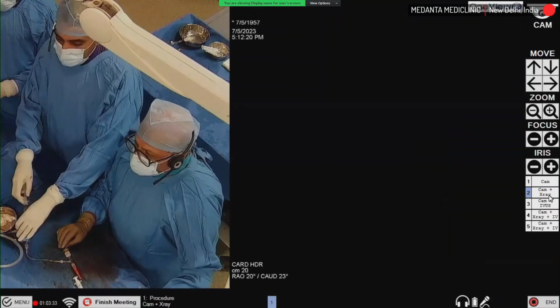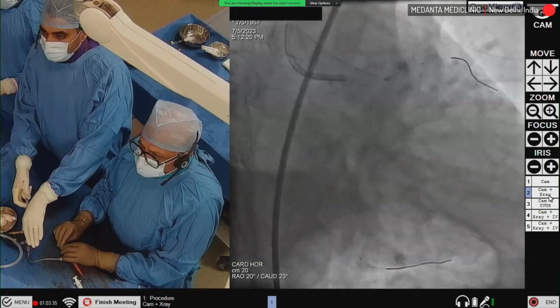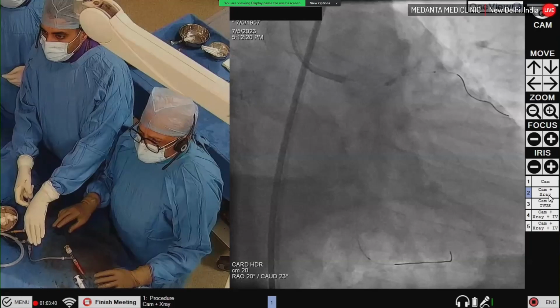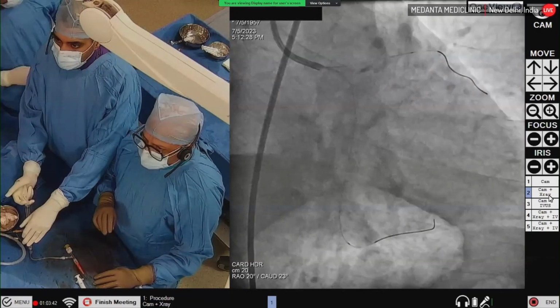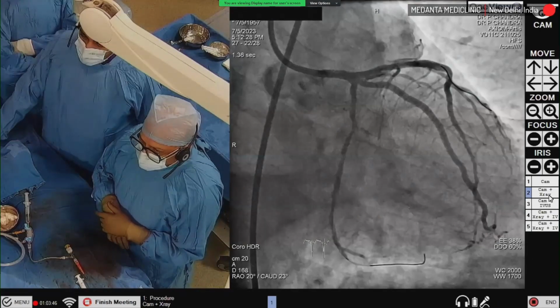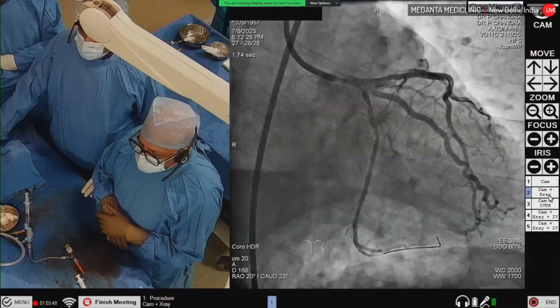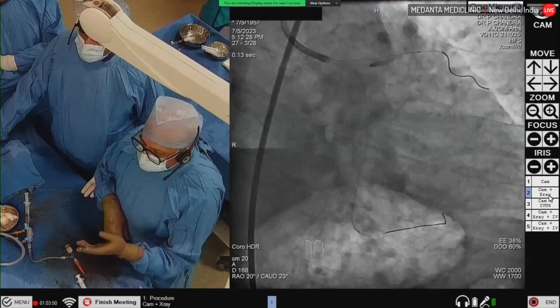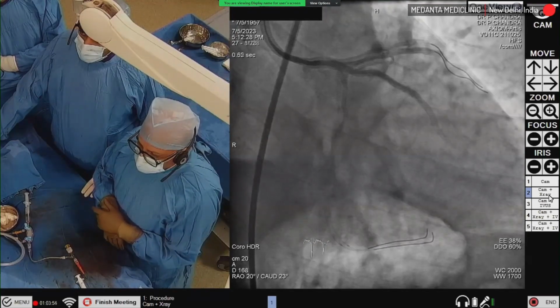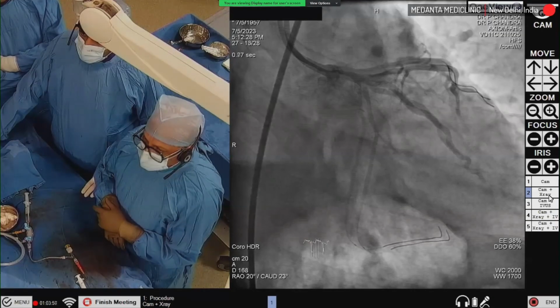So now we will look at it because there is some wedging. There is some disease in the left main. Okay, fine. Now check. Yeah. I mean, this vessel looks very good to me. I am tempted to do a DEB to this vessel also distally. Or we can put maybe 1 or 2 stents.